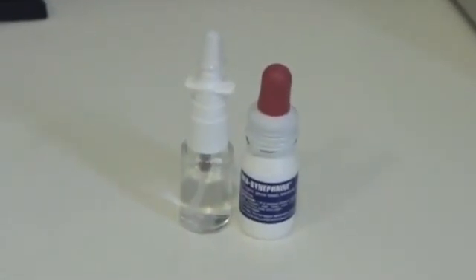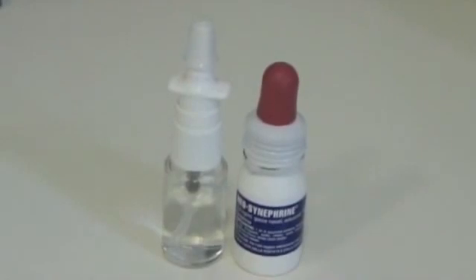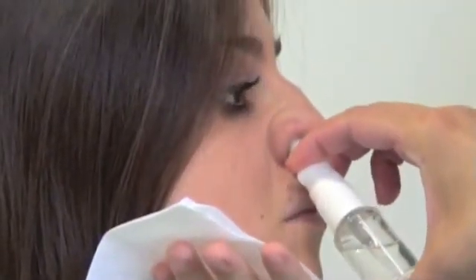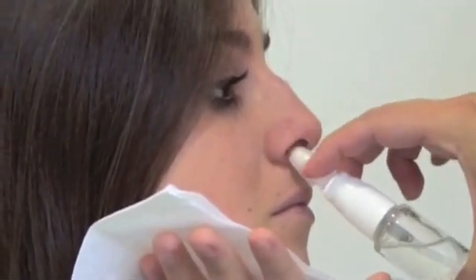The next test is the decongestion one. Phenylephrine is used. We make three puffs in each nostril.